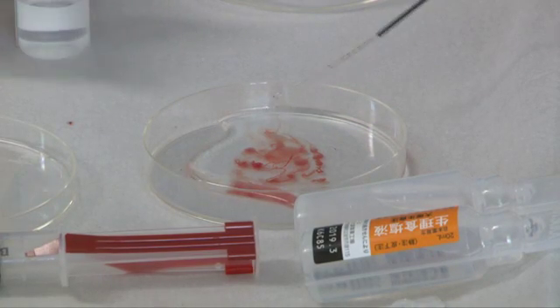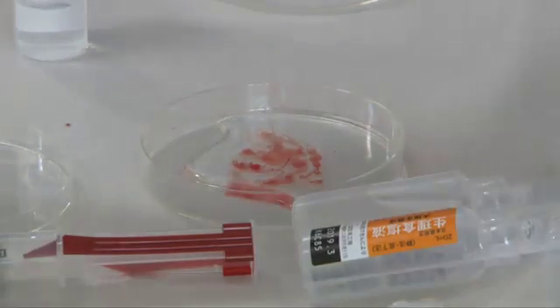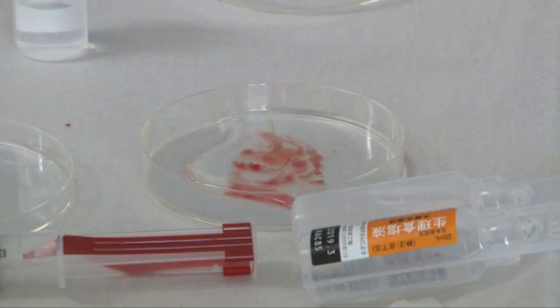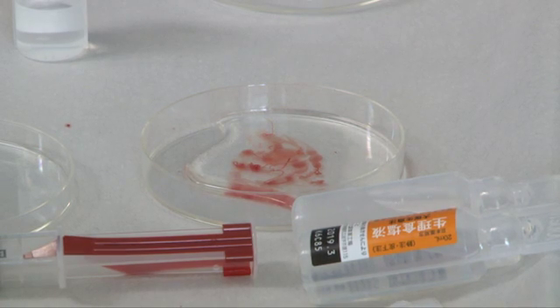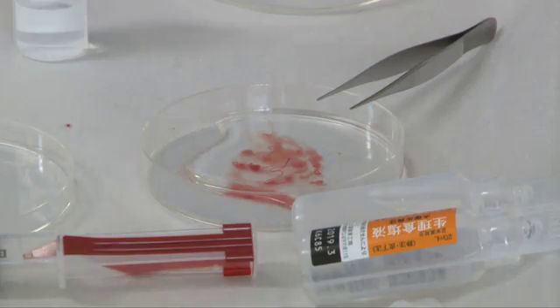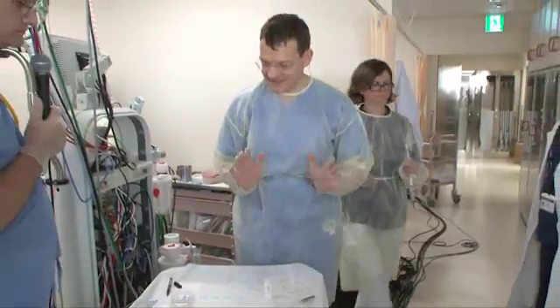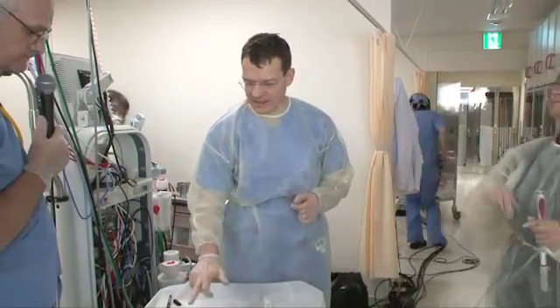I'm not sure if I understood. We would probably do a second. Again, it depends upon your pathology situation in your hospital. We do have a pretty good specimen here, but I think for us we would do a second puncture. Would you not do a second puncture? No, actually in this case I would not, because I have really enough.